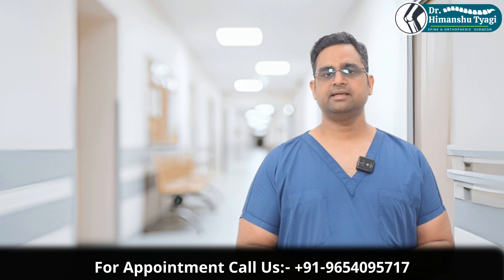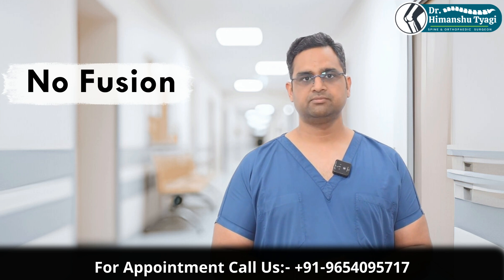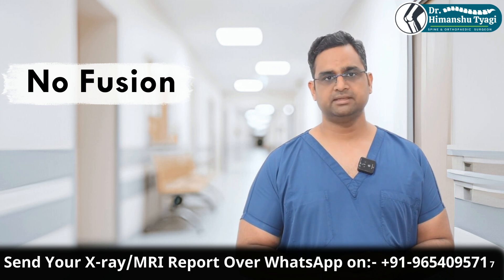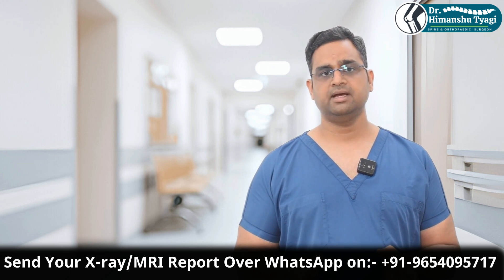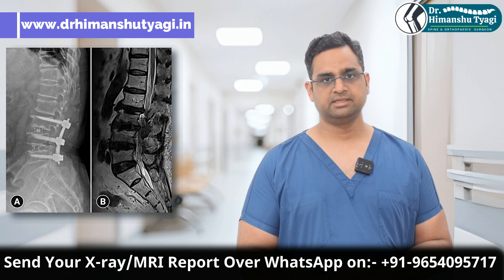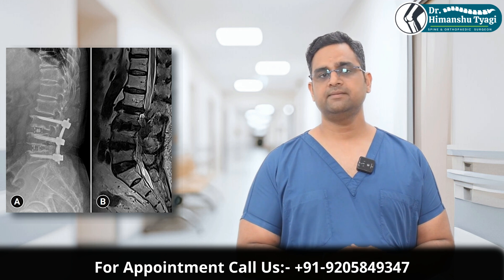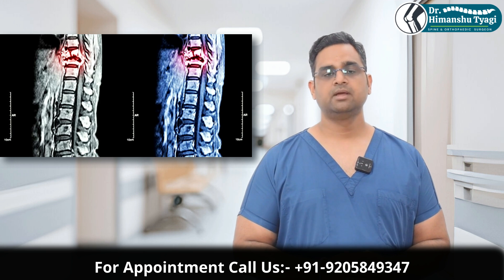The first reason is no fusion — that means the bone has not formed between the adjacent vertebras. In that situation, because of excessive pressure over these implants, the implant might fail. The second reason is if the implants are not put in the correct manner — basically if the implants are not taking the load in a biomechanically desirable way. Thirdly, it could happen because of some accident, trauma, or fall.